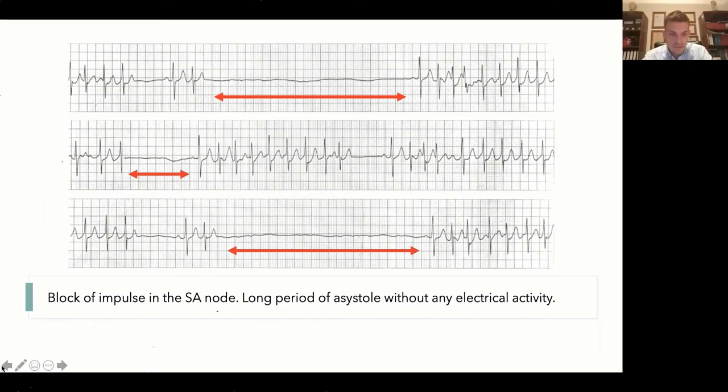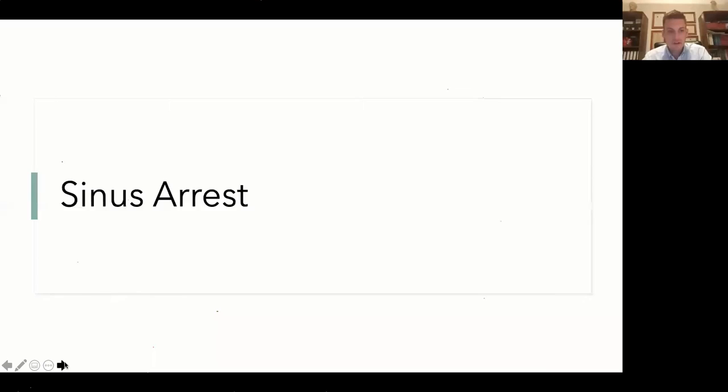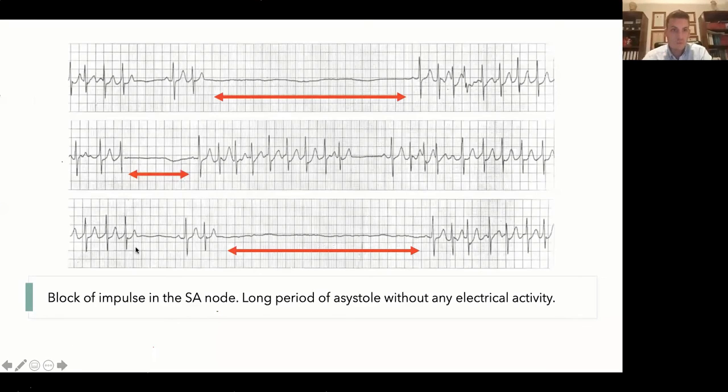So this means that there is a sinus arrest. Sinus, why? P wave before every QRS, it's hidden here. P wave, P wave, P wave, P wave here, P wave here, before every QRS, and then arrest. Why? Because then it stops, asystole. It doesn't fire, even though before it was firing properly, okay? So, I hope this makes sense.